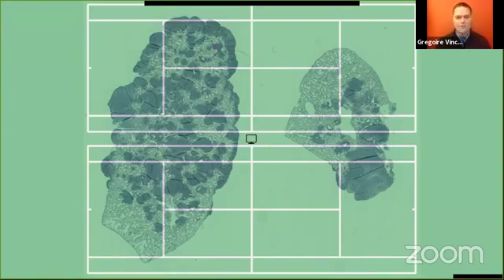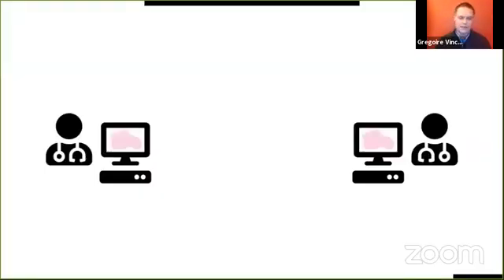And if I have to compare the role of a pathologist and a radiologist, it's like if you ask a radiologist to open 256 thorax X-rays of human at the same time in terms of surface of image to analyze. So the challenge here is very big, and it has an impact also on the weight of the images. The images are between 100 megabytes to sometimes more than 100 gigabyte only for one image.